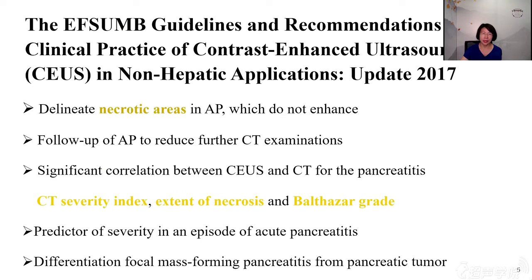According to the guideline of EFSUMB in non-hepatic application of CEUS, CEUS is very important in acute pancreatitis, especially in severe AP. It can find the necrotic area in AP. It can follow up AP to reduce the CT examination.